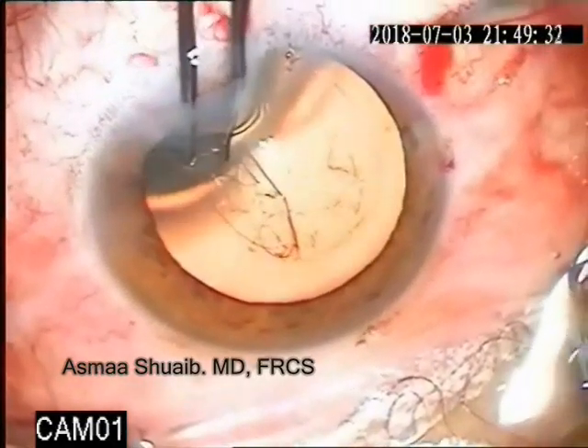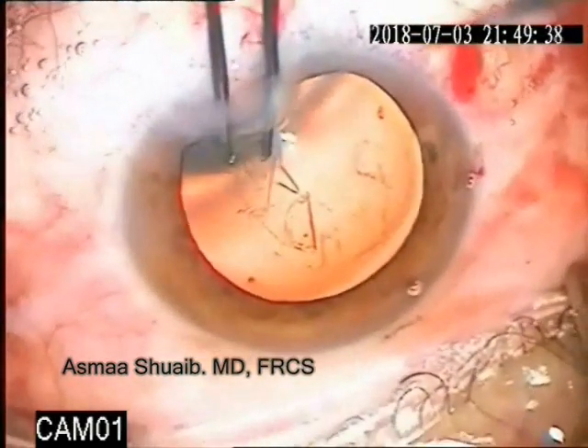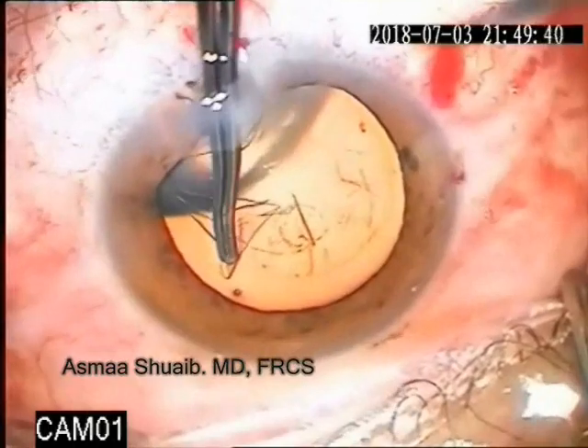This was difficult in this case because the extension happened in the sub-incisional part, so the ripping forces led to more extension.